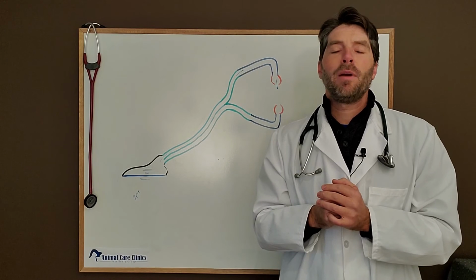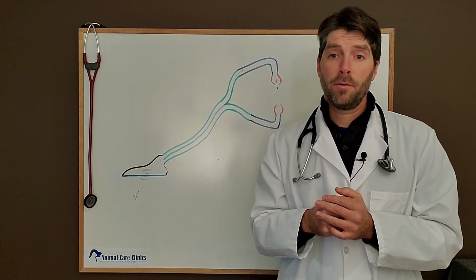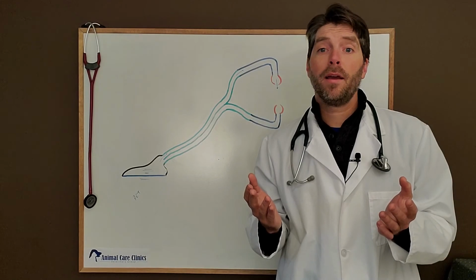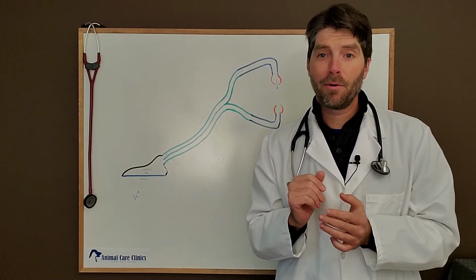Finally, I mentioned purring, so just for fun, here is my super happy cat through a stethoscope. Fun, eh? But you can also see why we really can't hear anything when they're purring. But don't get me wrong, we love it.